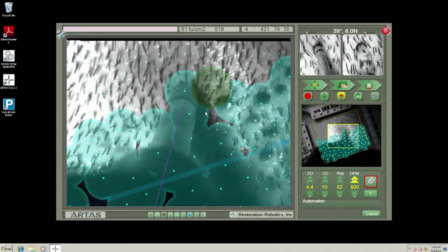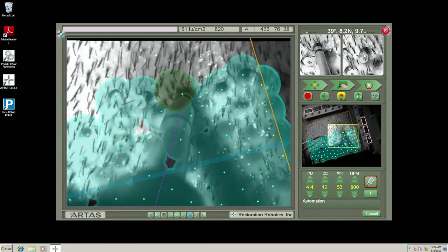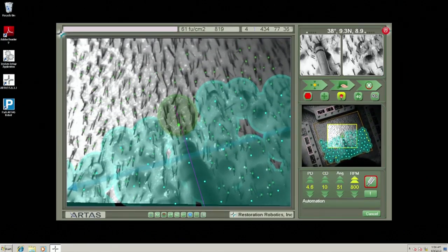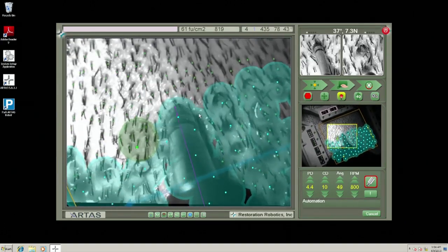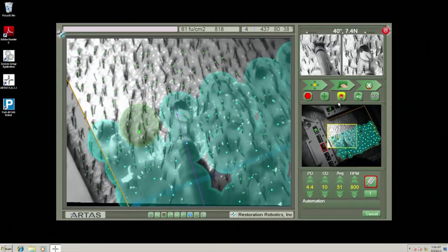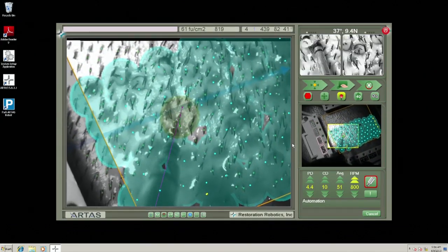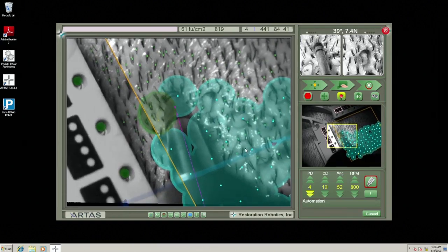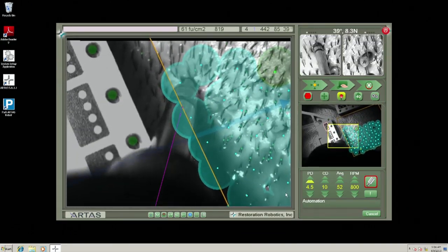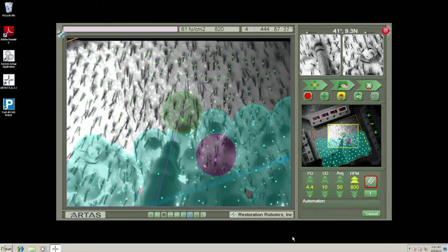You see some empty holes here because there are technicians running behind the robotic arm that are extracting as we go, so that they can start to count and do quality control measures. But if you look at the upper right hand corner where my mouse is, you'll see that graft is sitting in the hole, but it's slightly elevated. It is elevated at the conclusion of that second dissection, lifted up by a small pneumatic pump so it sits inside the hole just above the surface of the skin. That tells us it's been freed up from its intradermal or even subcutaneous fat attachments, and so it can be easily extracted using a jeweler's forceps. So that's the single most important thing in robotic FUE: optimal graft elevation, OGE.